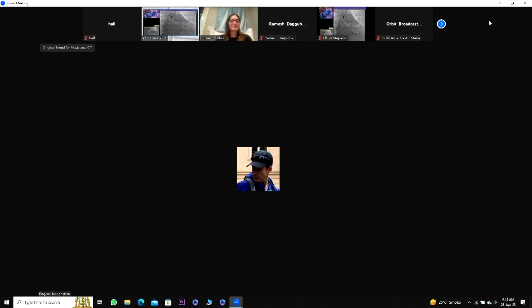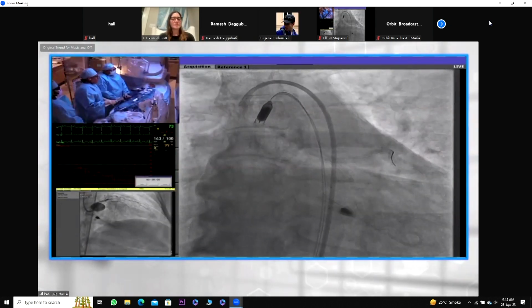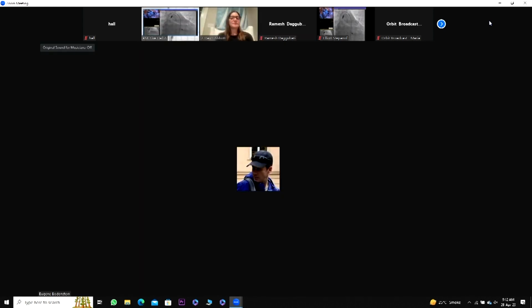So did you go with an NC balloon in your circ? Yep. It's a 3.5 NC in the circumflex. We're going to put a 3.5 NC in the LAD. We'll alternate high pressure and then finish with a KISS. Okay, great. Both 3.5.